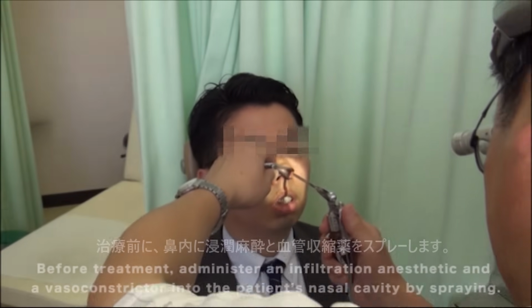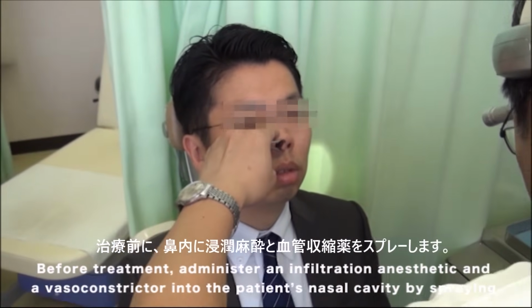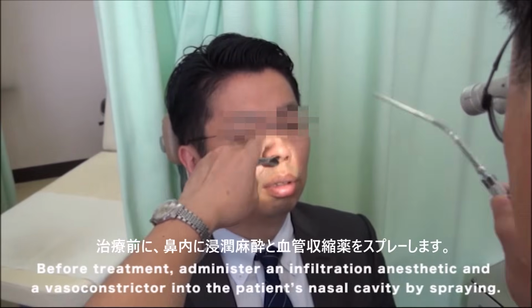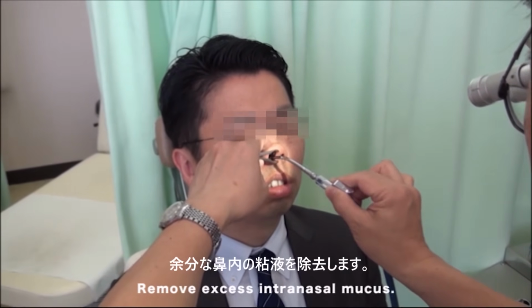I will now show you a video demonstrating the actual catheter usage technique. Before treatment, administer an infiltration anesthetic and a vasoconstrictor into the patient's nasal cavity by spraying. Remove excess intranasal mucus.